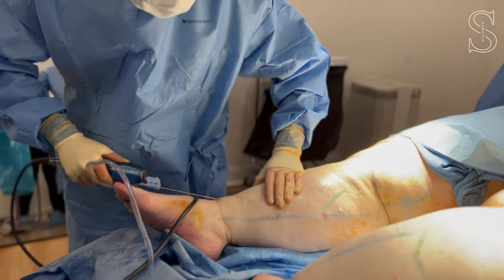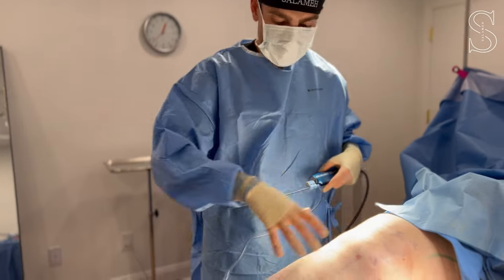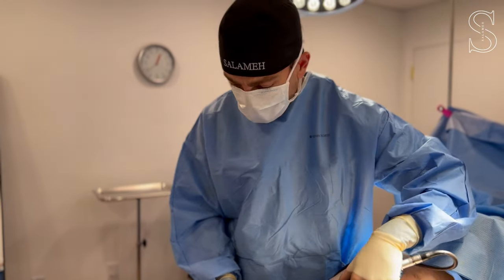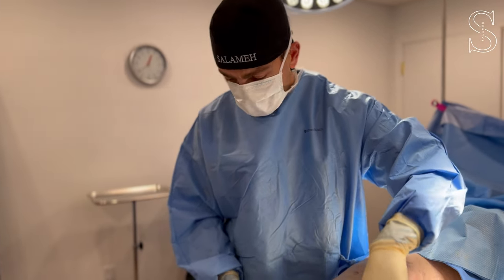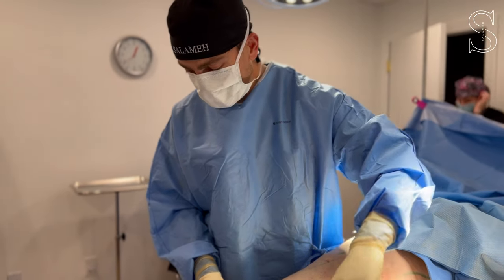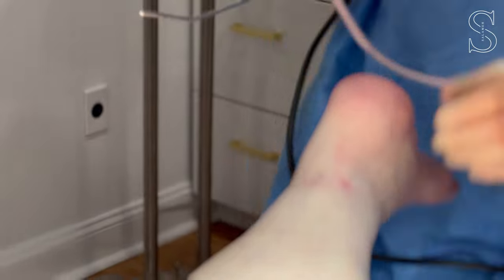Look at this ankle, looking so good already. We used to do them asleep, and then when we shifted to awake, it's been a game changer. You see the patient's holding her leg, she moves around, she heals. Now we're gonna have her stand up and take a look, a standing liposuction in a way. We see when they stand up if there's any area that we didn't get. So it just helps in every aspect. And you see now I'm doing her foot with this micro cannula here, and it's been a game changer. Recovery is better, everything's better. Today you'll have ankles, next time you'll have knees.